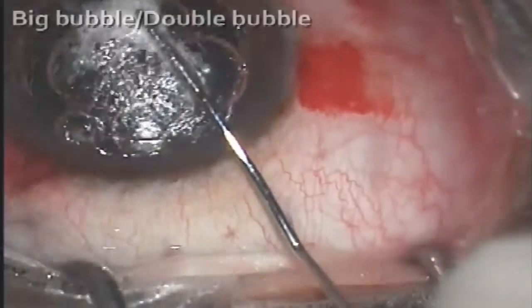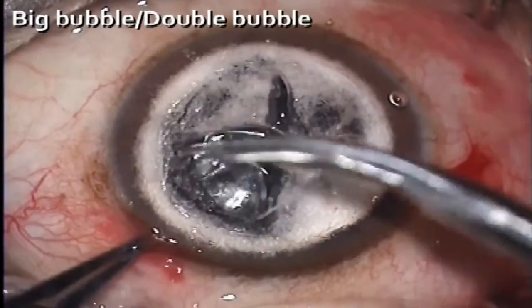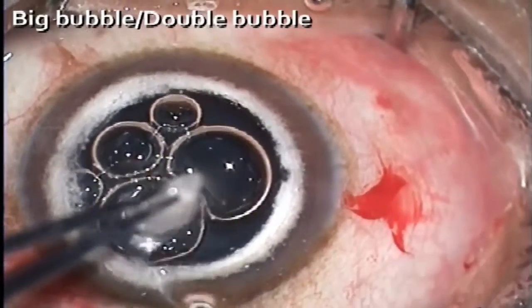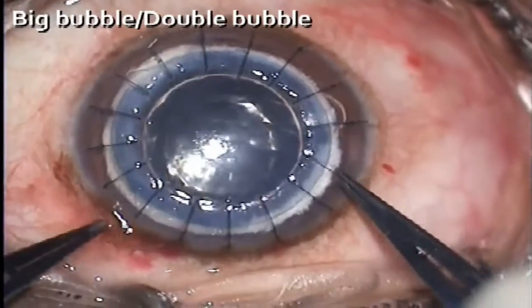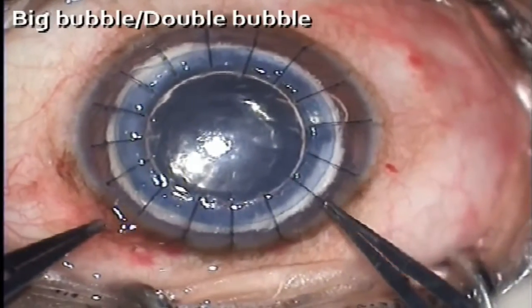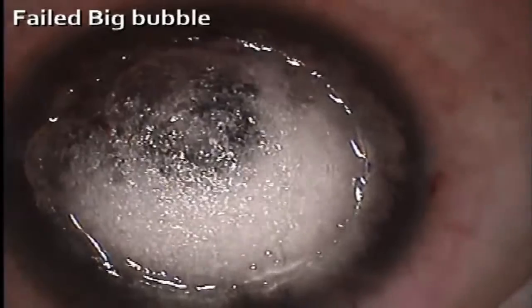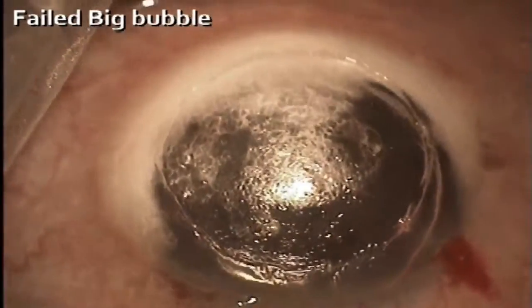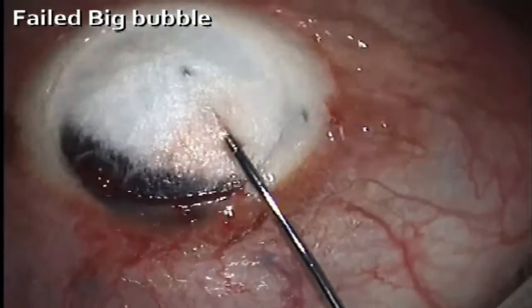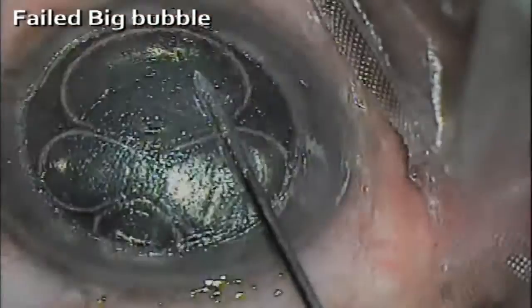Big bubble is the most popular technique for Descemet separation in deep anterior lamellar keratoplasty. It is a challenging yet rewarding corneal surgery. It is not always easy to achieve the big bubble — finding the right depth can be quite difficult at times.